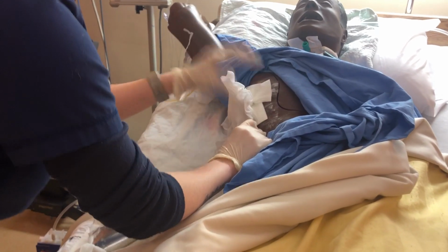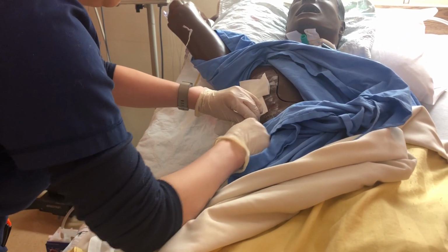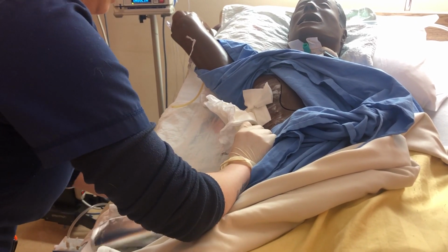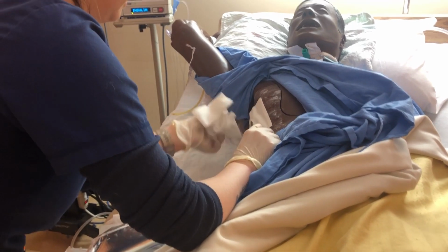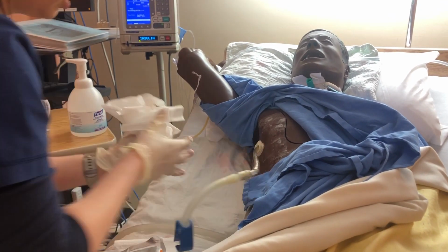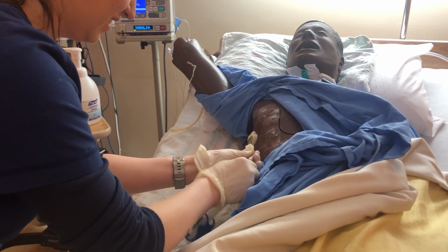Okay. Well, that would stay connected. And we'll just grab the dressing off. I'm assessing for drainage, any unusual drainage. It looks good. This needs to be taped better.